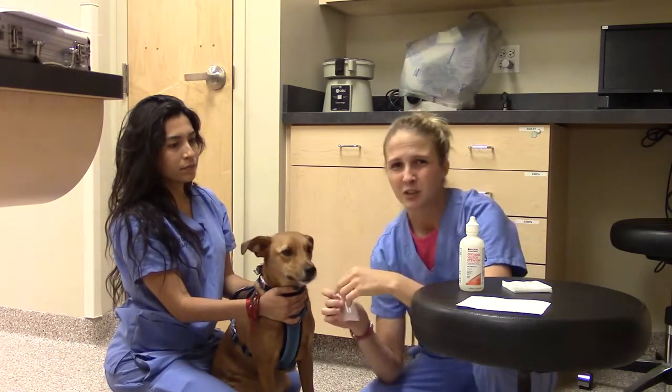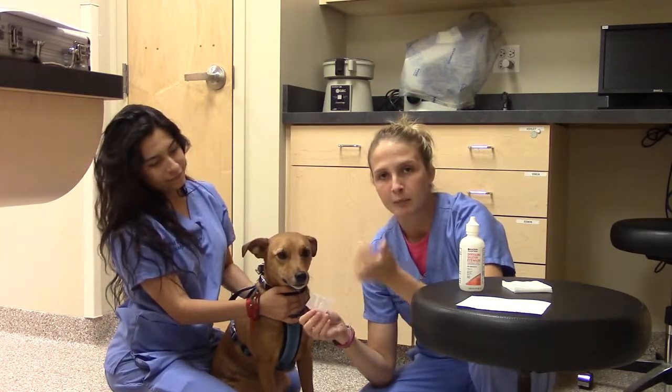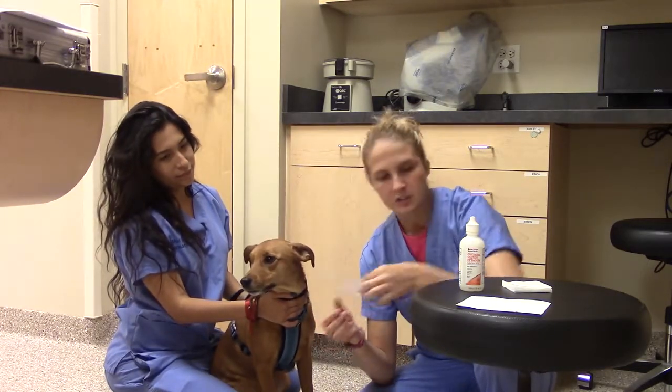The Schirmer Tear Test is best to do first if you're doing multiple eye tests, just because you don't want to alter the eye at all. You don't want to put any of the fluorescent dye in there, or any sort of anesthetic to the eye. So go ahead and do that.